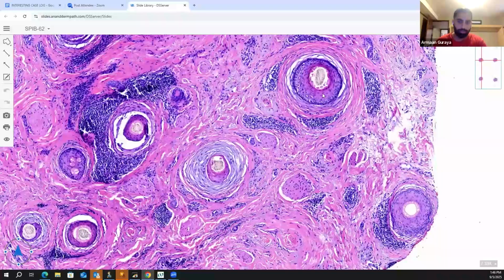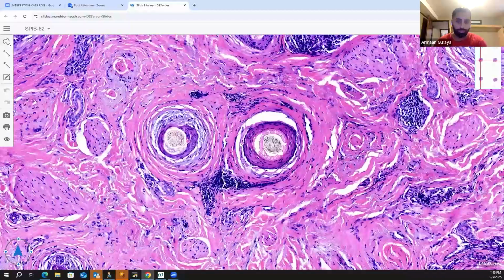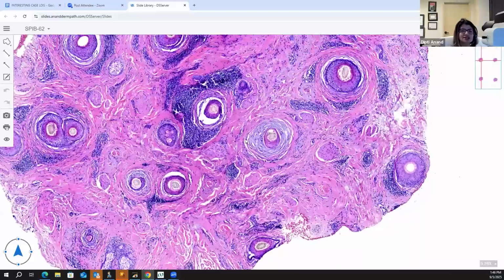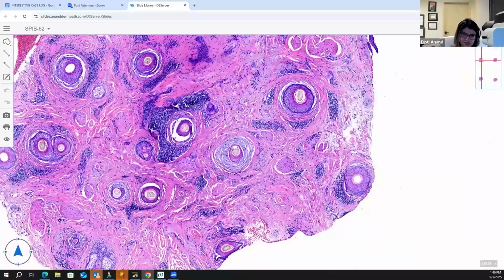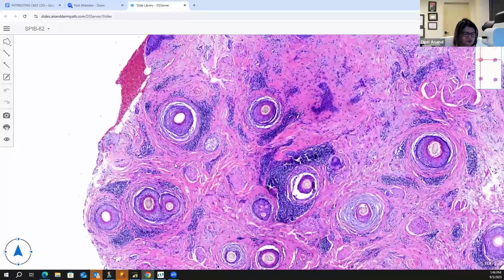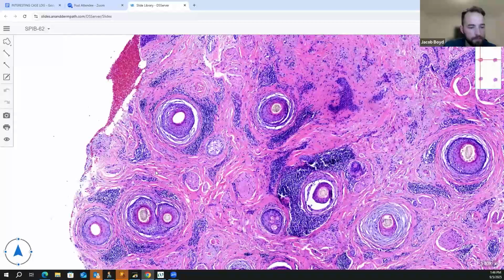Okay. What was this finding called again? You said mucinous fibrosis? Perifollicular fibrosis. It's like a concentric perifollicular fibrosis. To my eyes, it really looks like a neurofibroma-like stroma. So this, kind of like two shafts. I'm forgetting what it's called. You know what I mean. I'm forgetting the pathology name of it. Polytrichia or whatever. Yes, yeah.